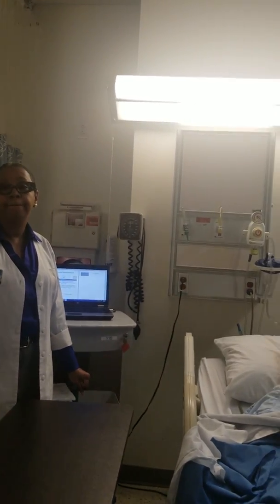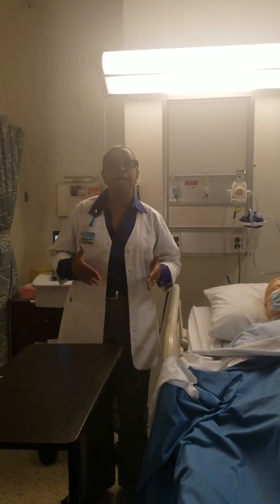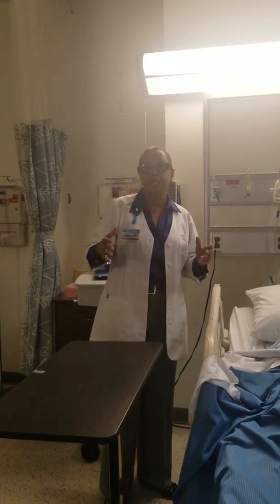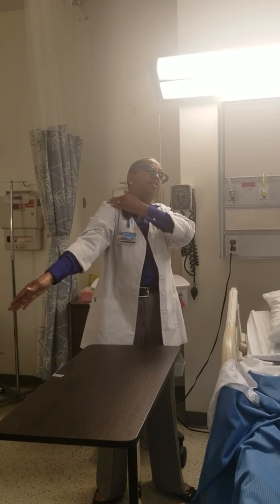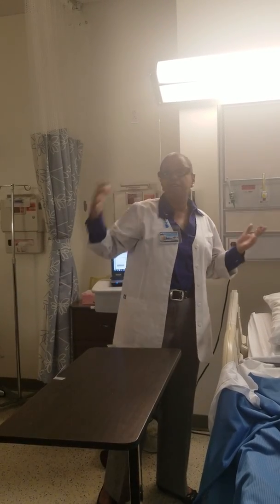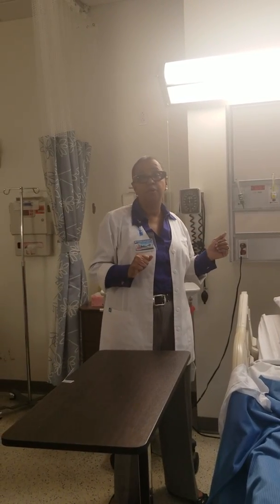All right, so that's your central line. And like I said, central because of where? Because it does what? Superior vena cava. That's what makes it central. Other than that, it is considered peripheral. If it moves out here, my PICC line is peripherally inserted. It started here, it had a long catheter. They put it all the way up here, and it rested in the superior vena cava. If it's central, I can shoot an X-ray and it says it's in the superior vena cava. Okay, and I said, good, we're good.